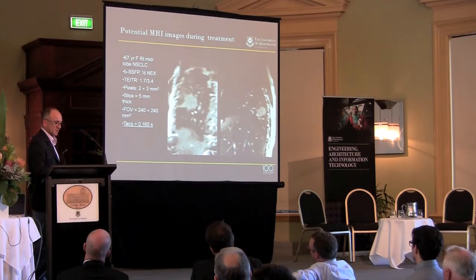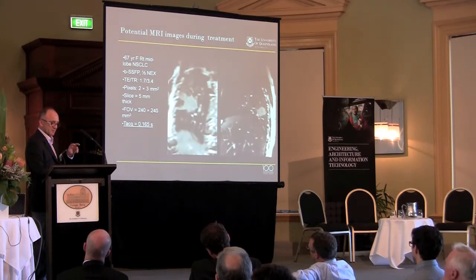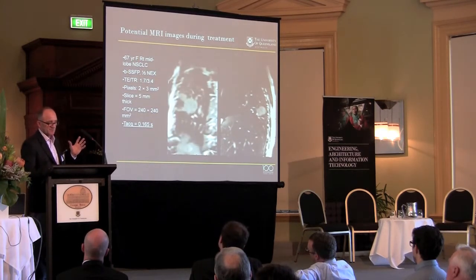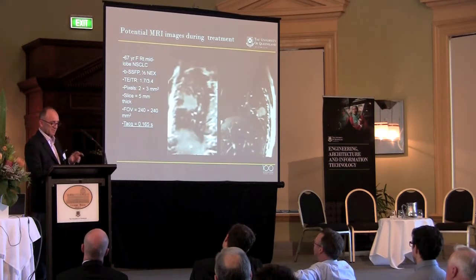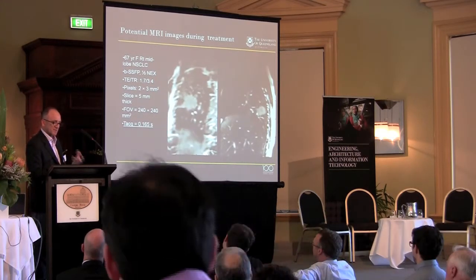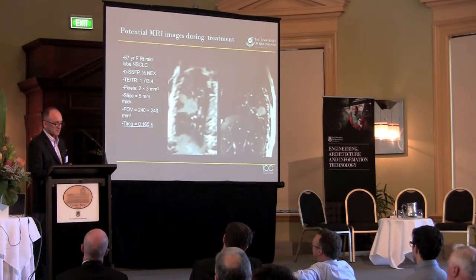And that's how radiation therapy works. It assumes that the tumour is fixed in place, and a treatment plan is made to irradiate the tumour and give it as high a fractional dose as is possible. But it can't account for tumour motion. It does a fixed plan at a fixed moment in time. The clinicians, the radiation oncologists, then necessarily make the plan very wide because they know the tumour will move, and so do we. You can see the tumour moving a couple of centimetres easily. So healthy tissue is necessarily irradiated, and the tumour itself doesn't get the high enough dose that it needs for treatment. So patients have to go back for repeated treatment. Healthy tissue continues to be irradiated, and eventually the tumour gets a high enough dose.